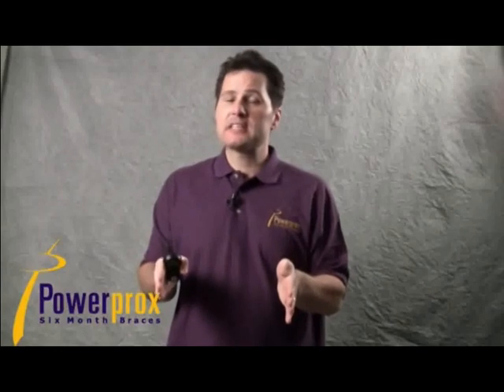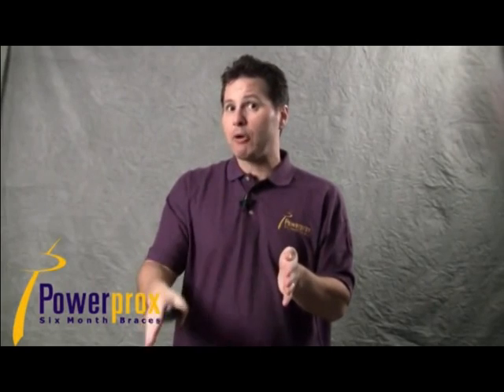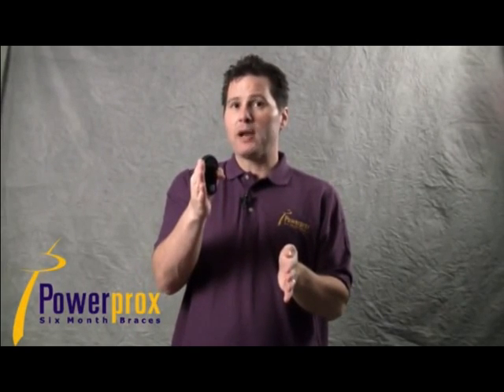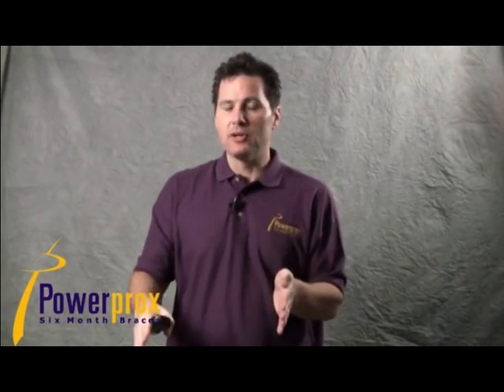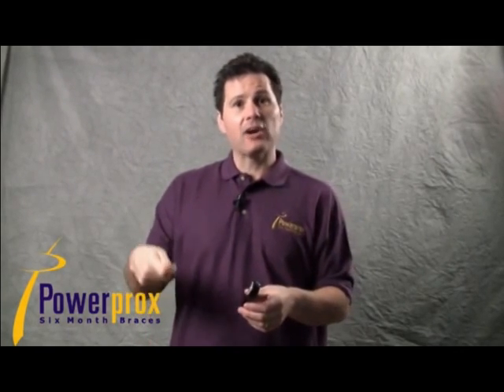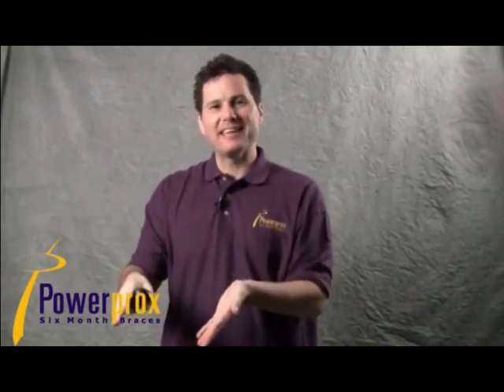Now remember, one of the things I said about the open coil spring, besides maintaining space, you can use it to change the direction that knotted power chain is pulling. In this case we didn't want to pull it just straight down, but we wanted to also pull it towards the distal. So we have the knot anchored more towards the distal, and the open coil spring can help keep it there. So we're killing two birds with one stone, bringing that canine down and also moving it distally.